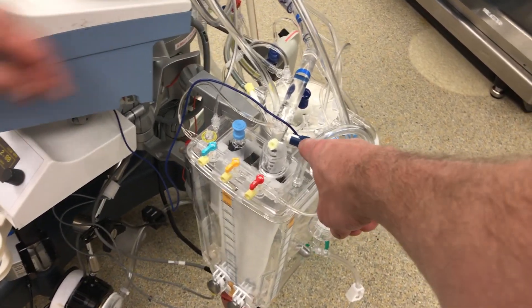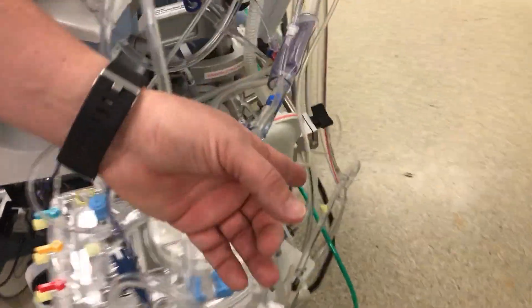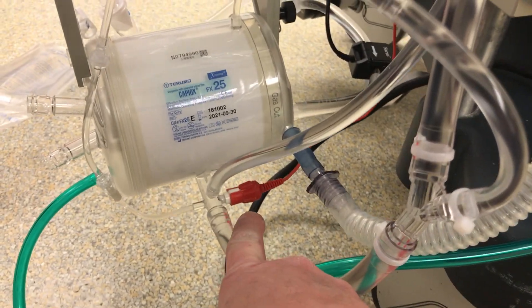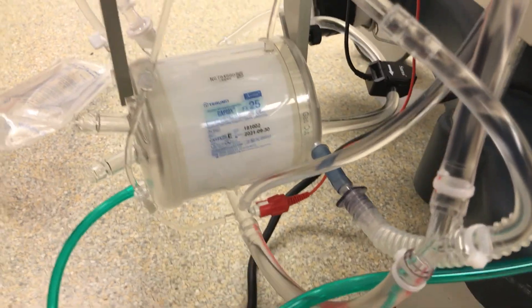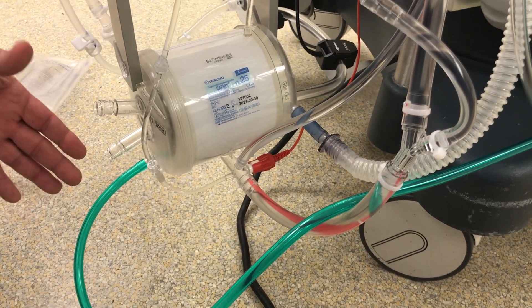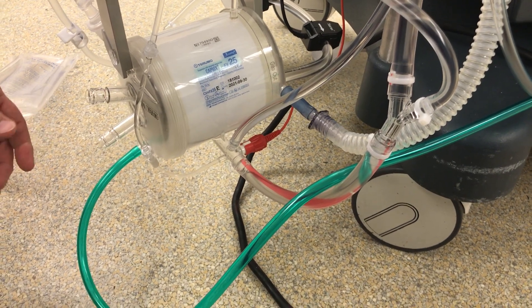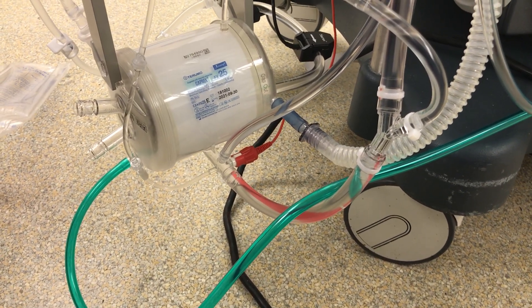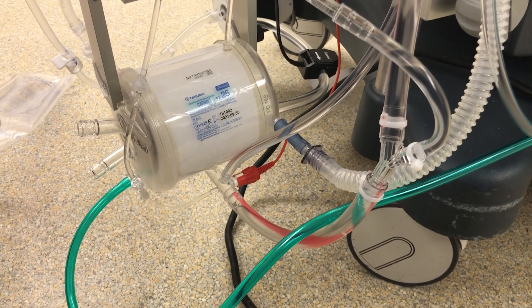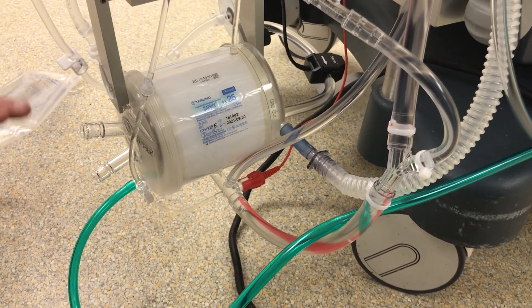These cables include the venous temperature sensor, and there's an arterial temperature sensor down on the oxygenator. Those tell us the temperature of the blood coming out from the patient, and the red one is the arterial — the blood going back into the patient. The green tubing is the oxygen line. We could use 100% oxygen, but we find it's better on the lungs, brain, and blood gas properties to use a mixture. We generally start with maybe 80% oxygen and 20% medical-grade air, and as the patient cools down, we take that percentage down.